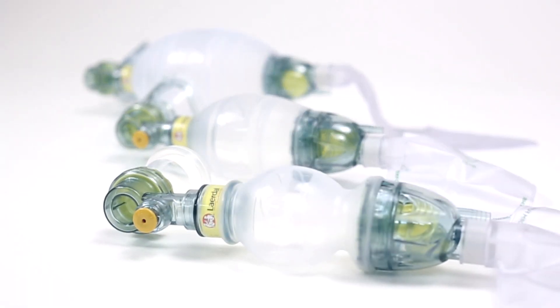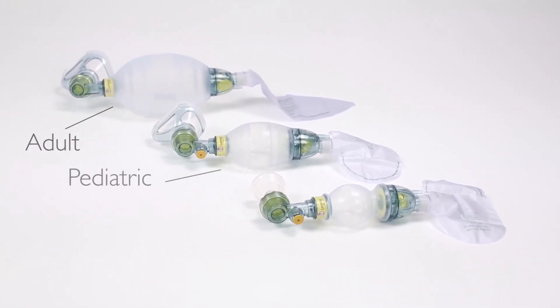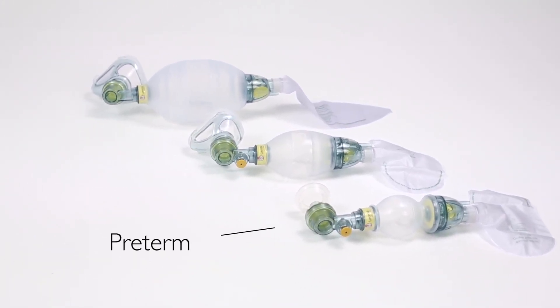The LSR is available in three configurations: adult, pediatric, and preterm.